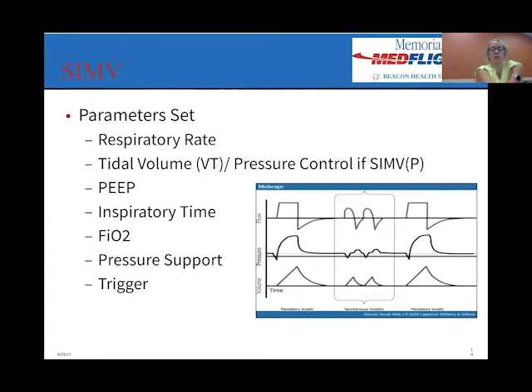In SIMV, you're going to set your respiratory rate. Again, if they're breathing above it, that's fine. You're going to set your tidal volume or your pressure control, your PEEP, your I time, your FiO2, pressure support again, and your trigger.